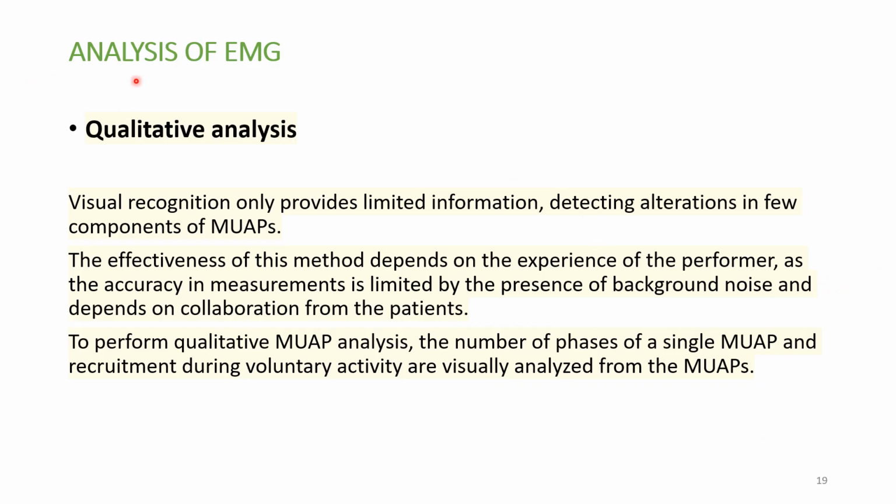Now coming to the analysis of EMG. How is EMG analyzed? That is by qualitative analysis and quantitative analysis. First, coming to the qualitative analysis. What is qualitative analysis? We will see the recording. This is visual recognition only, but it provides limited information.